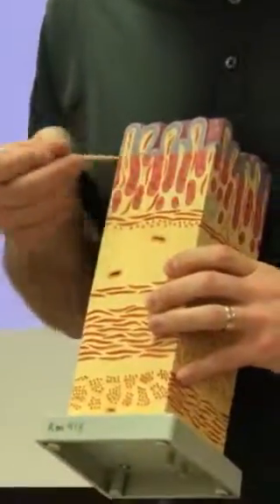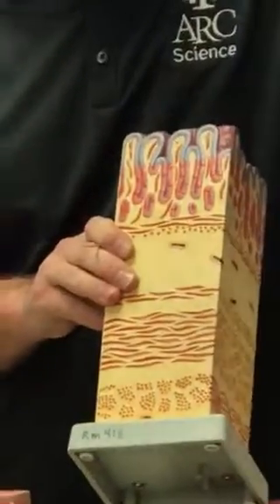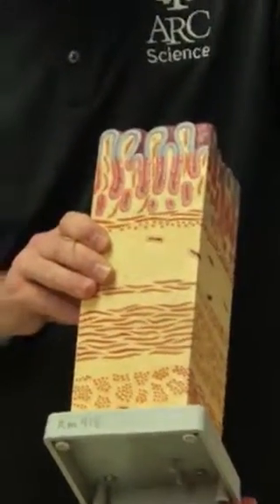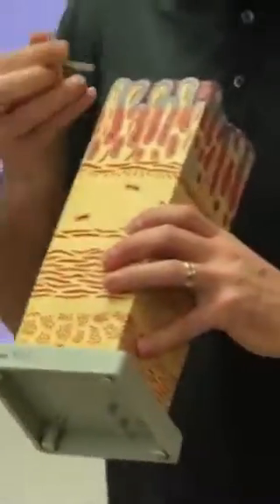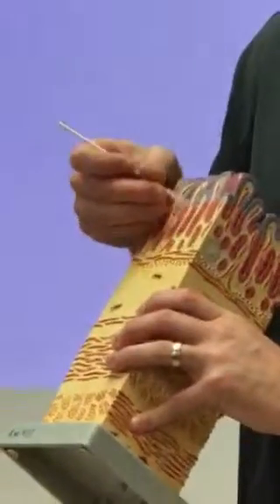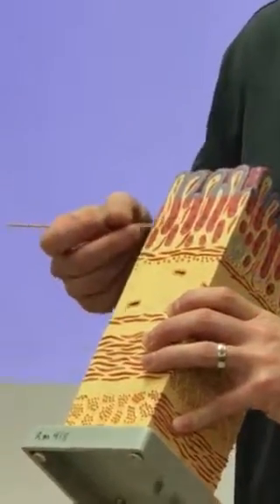And then when you get into the glands, in addition to mucus cells, you also have chief, parietal, and enteroendocrine cells, G cells in particular. So it's hard to tell what's enteroendocrine and what's chief, because they only give us 2 really distinct cells. But these really big red ones, parietal cells, definitely. Parietal cells are quite large. But other than that, it's a mixture of G cells and chief cells.